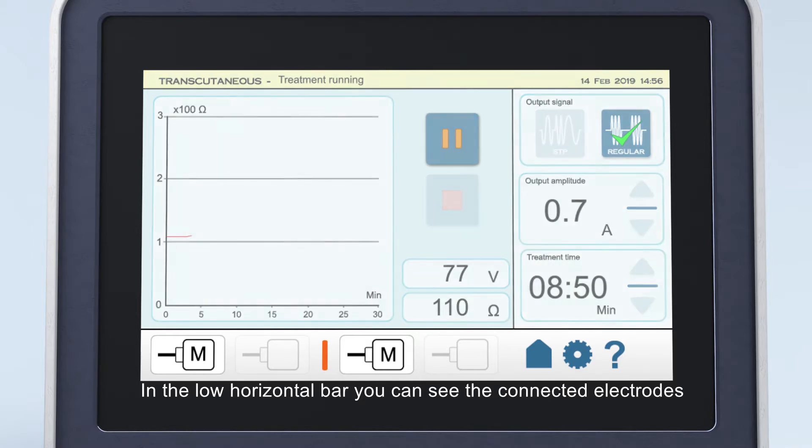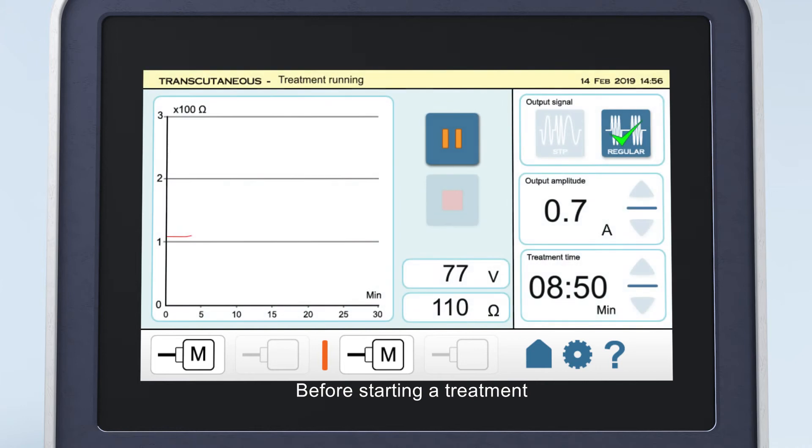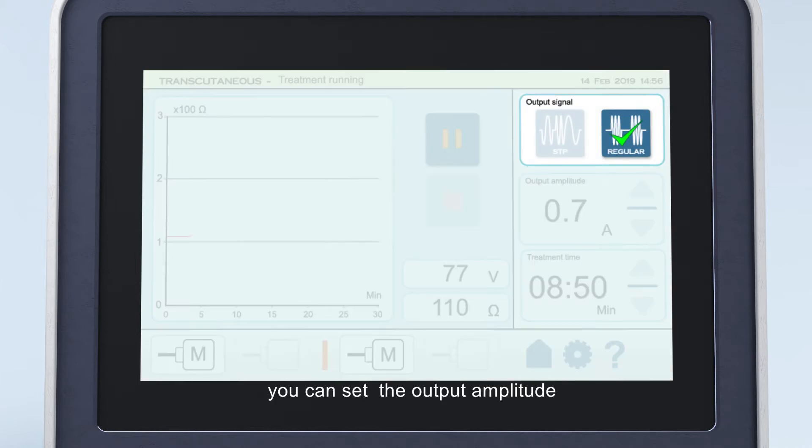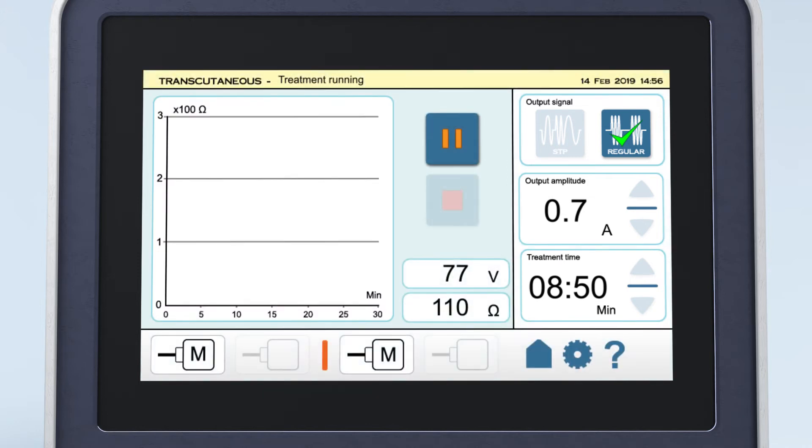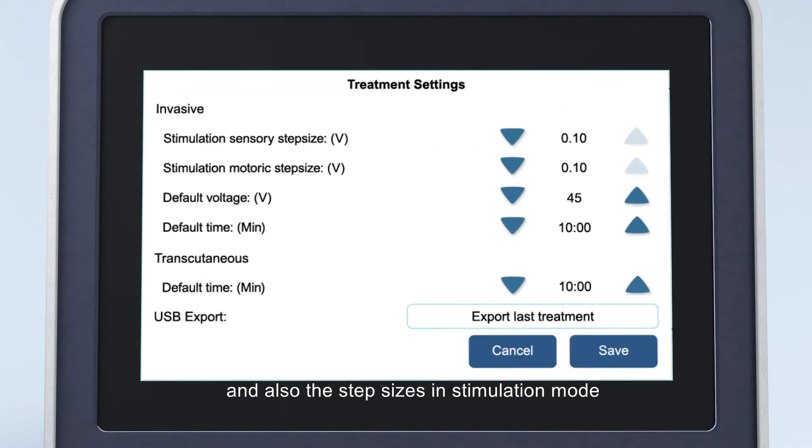In the low horizontal bar, you can see the connected electrodes. Before starting a treatment, you can set the output amplitude, treatment time, and you can monitor the impedance. In the settings menu, you can change the default settings and also the step sizes in stimulation mode.